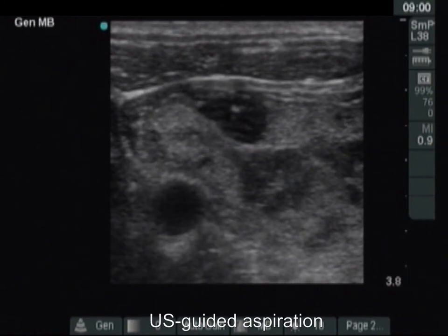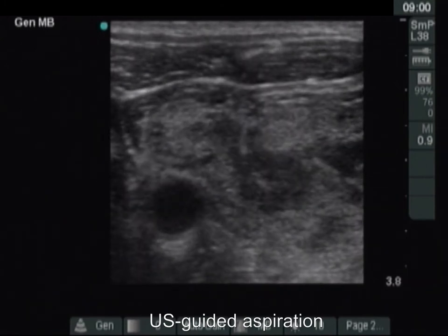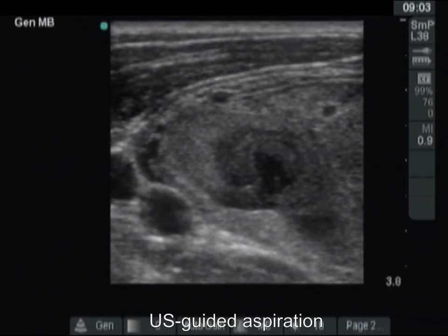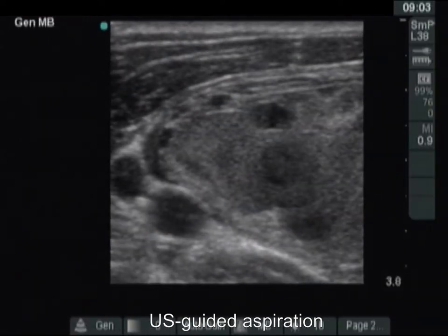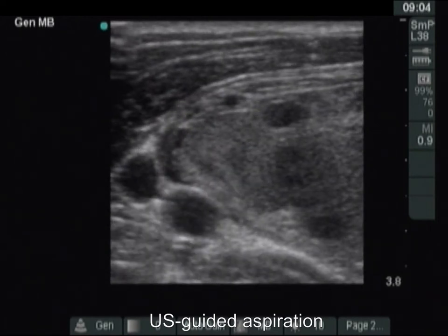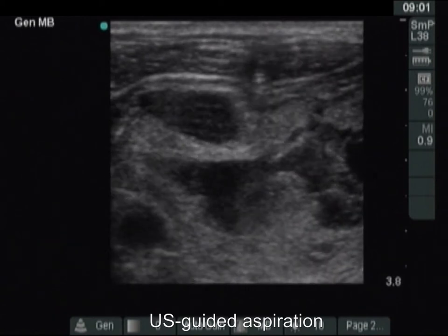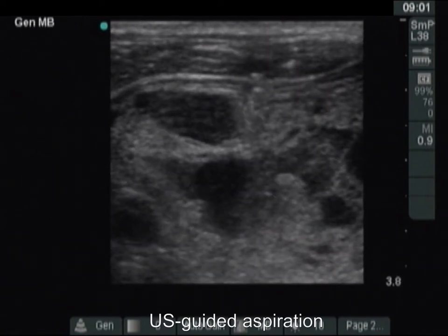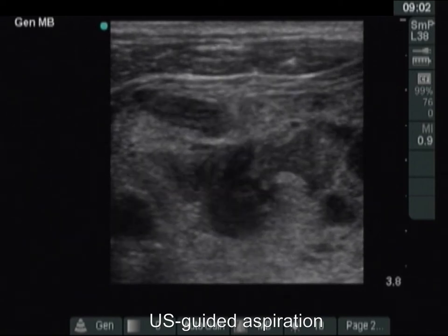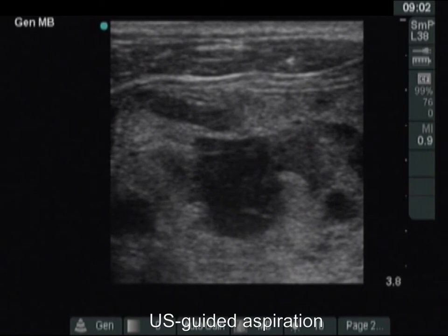We aspirate the ventral cystic chamber, but the increasing moderately hypoechoic dorsal area means that while emptying the cyst, the lesion is getting refilled at the same time. Another attempt of aspiration follows. I have already aspirated 18 milliliters of bloody fluid until this time, but the size of the nodule remained the same.